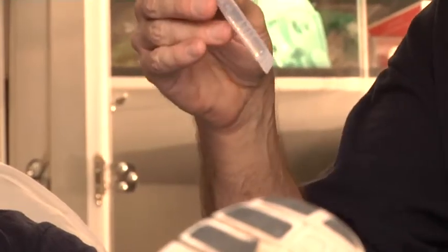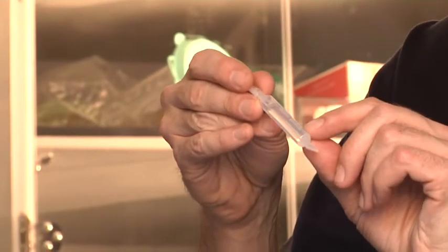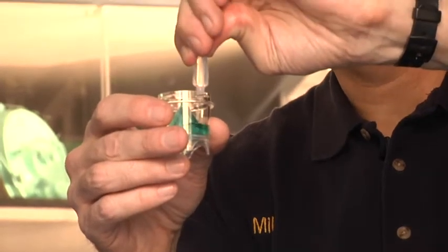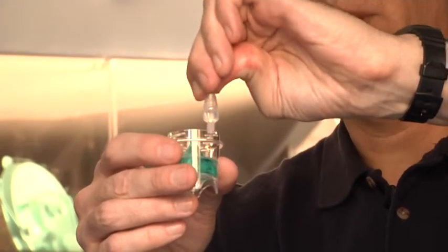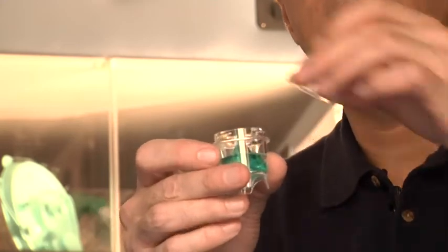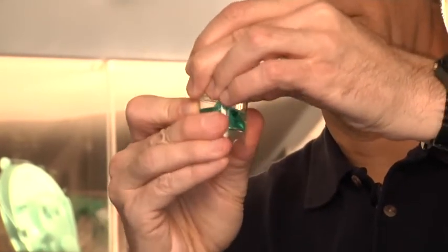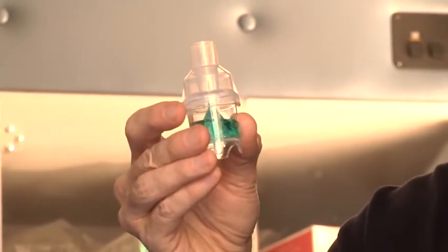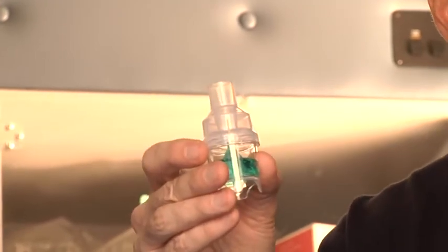We'll take the albuterol and check the expiration date of the medication to make sure that it's still in date. Open up the medication and make sure that what's listed on the outside of the package is what's actually inside. Twist off the top and squeeze the albuterol into the nebulizer. The albuterol, in this case, is pre-mixed — that was a unit dose, meaning one package of it. We then attach the top of the nebulizer.